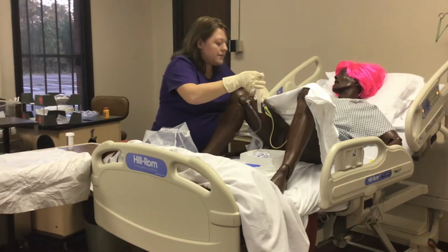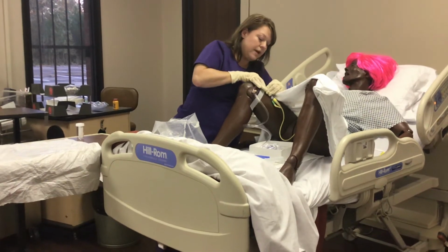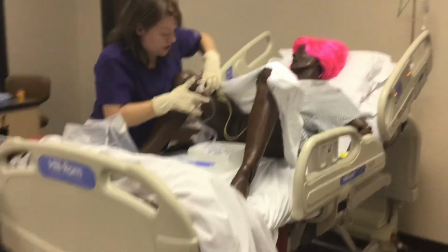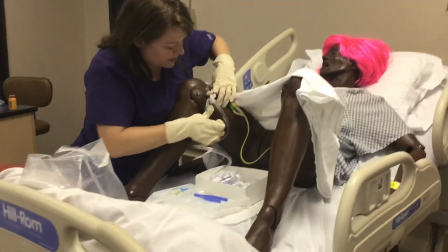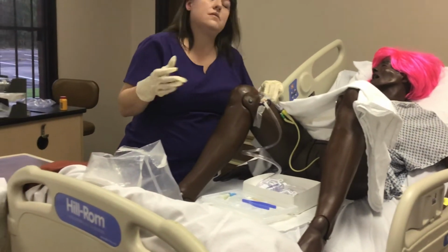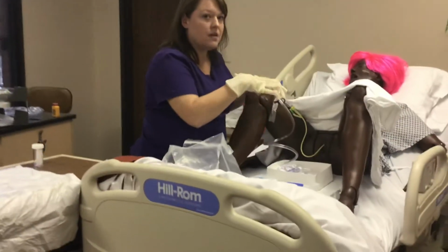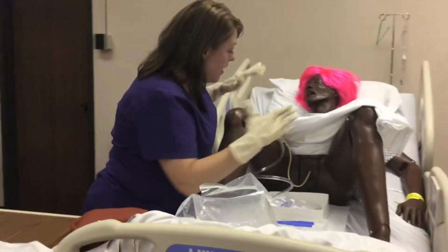And all while I'm taping it, I'm making sure that I'm leaving enough slack so that if she does have to get up to go to the bathroom, she has enough slack in her catheter that she's not going to pull it out. Sorry about that. This is Shelton. I use paper tape because in the hospital, more than likely, hopefully, we'll be using the adhesive pads to go with it or the strap. I've taped it.